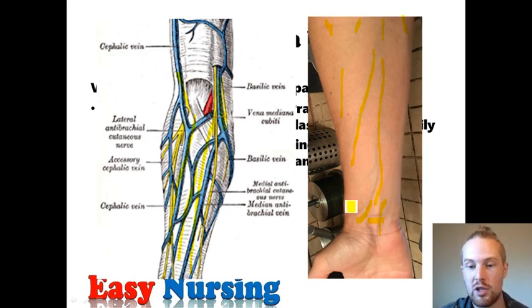I told you about the squishy vein. You can see part of it right here along more the side or the top of the forearm. And this is going to be almost the same on every patient. So once you find a vein or a series of veins that really work well for you, you can go to them every time. But let's go ahead and talk a little bit more about visualization. What are we looking at?